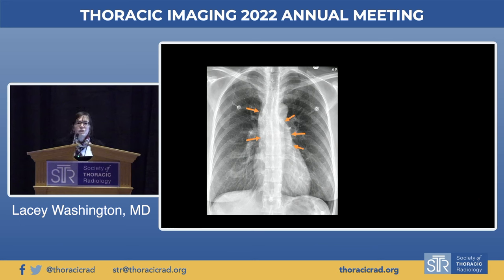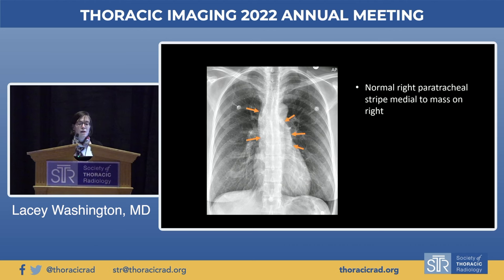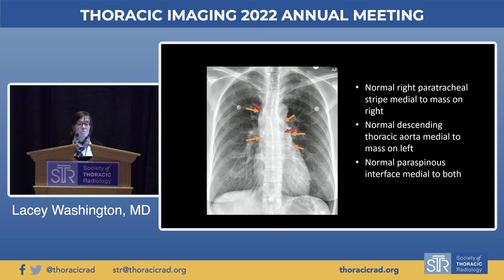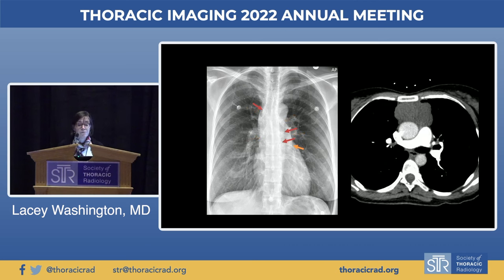This is an extremely subtle case. You can see a normal right paratracheal stripe medial to the mass on the right, the normal descending thoracic aorta medial to the mass on the left, and a normal paraspinous interface medial to both. This is hard to see, but there is a mass here — all these interfaces being well preserved suggest it's probably anterior or prevascular.